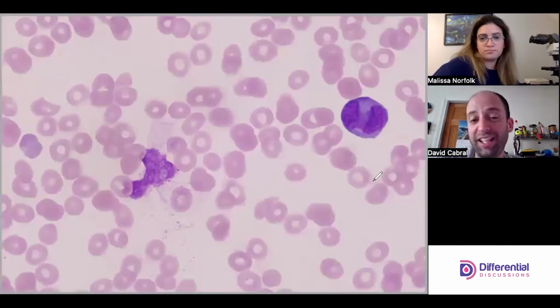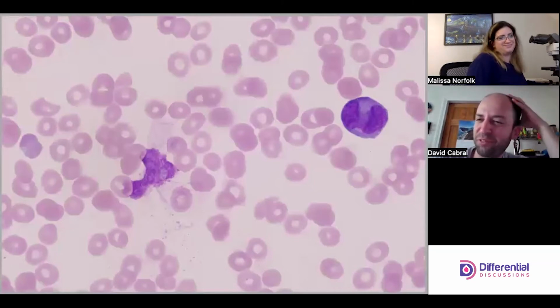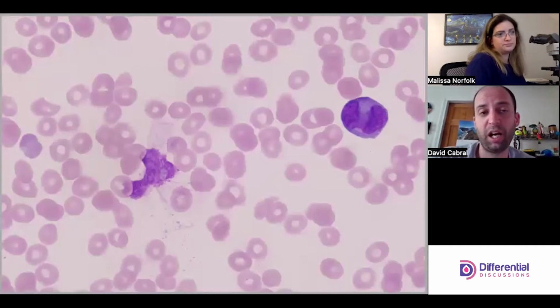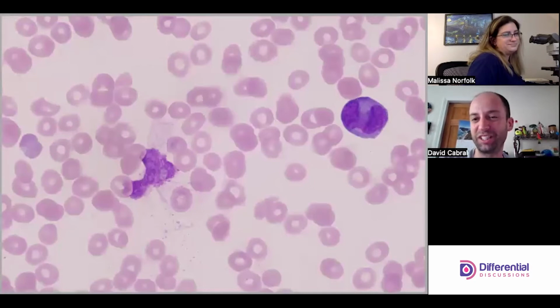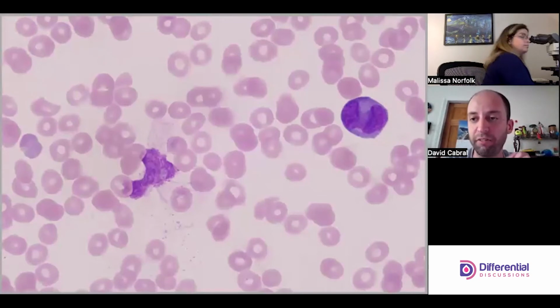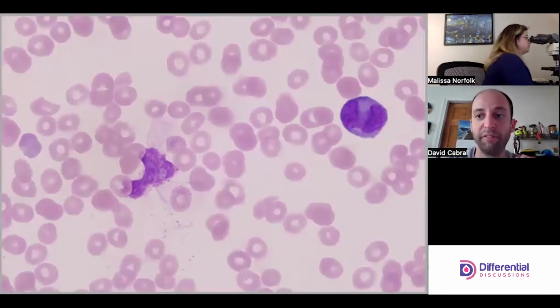Right. And classification of these cells has always been kind of bothersome for me, because they're promyelocytes, right, Melissa? I mean, are they the same promyelocytes that are in my other patient that has a left shift? No, they are not. They're much worse than that. So how these things get reported might be variable. I haven't been at a ton of different institutions to know. So just note that we're calling them promyelocytes, but these are certainly very malignant cells that cause a lot of disease.